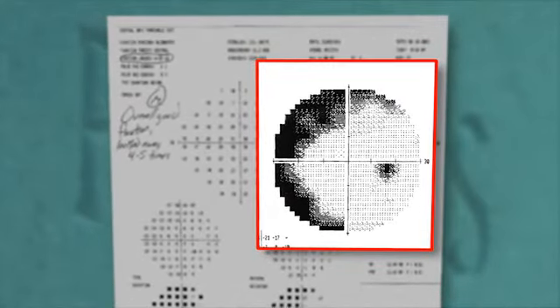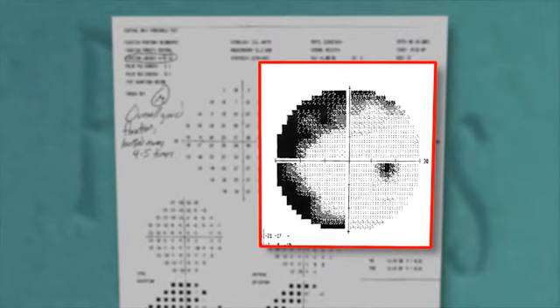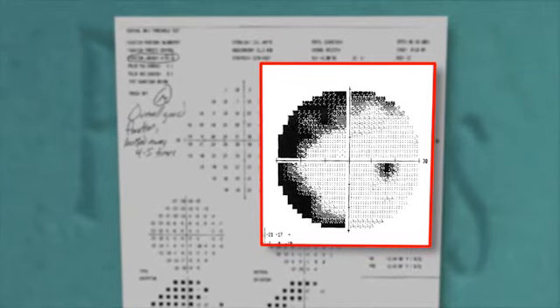Where it's gray, the target has to be quite bright for him. And where it's white, off to the right in his temporal field, he's seeing it normally. So he has what we call a nasal field constriction.